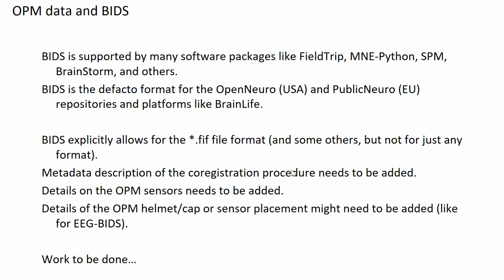The parts that still need to be added, for which we don't have the standard procedures yet, are the metadata description of the co-registration procedure, because we have multiple co-registration procedures. The details of the OPM sensors, because OPM sensors are more variable between vendors. And the details on the OPM helmets or caps and the placement system need to also be added. And this is where there's definitely work to be done in the BIDS community together with the MEG community to improve the documentation of the data.